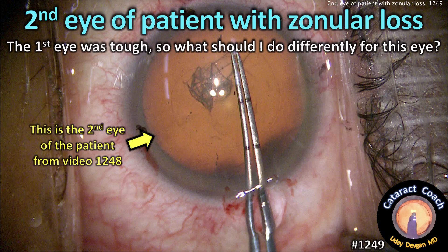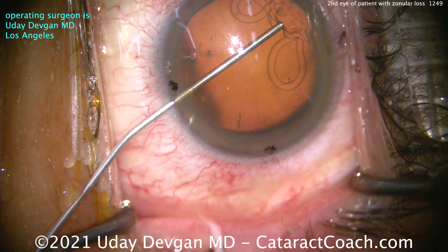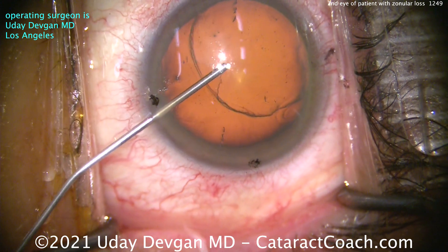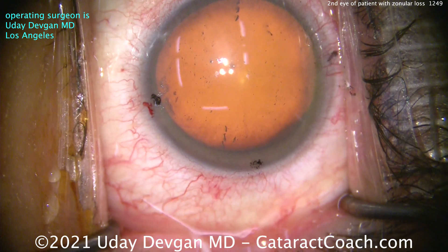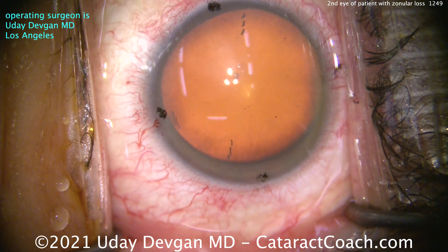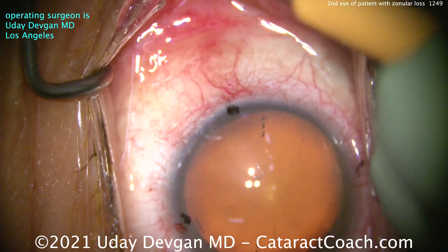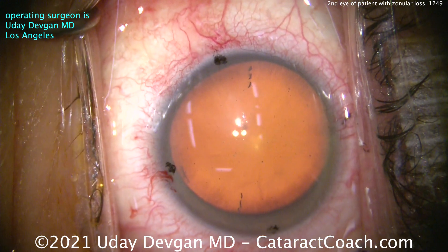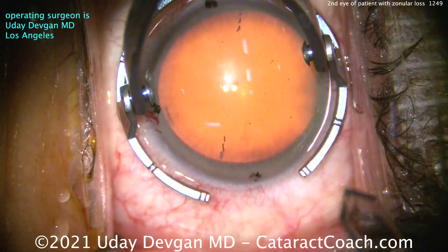cataractcoach.com — the second eye of a patient with zonular loss. The first eye was tough, so what should I do differently for the second eye? We've already marked the cornea — those are the toric markings showing where we'll line up our IOL. It's going to be an EDOF extended depth of focus toric IOL. Remember the first eye, which was yesterday's video number 1248, showing the extensive zonular weakness and loss. That was a tough video, shown at two times normal speed. This video is going to be at real time.